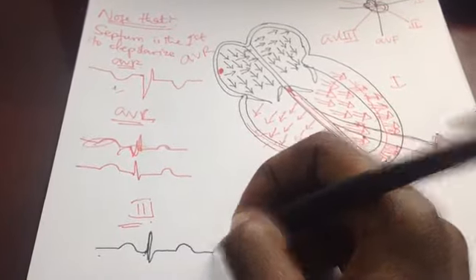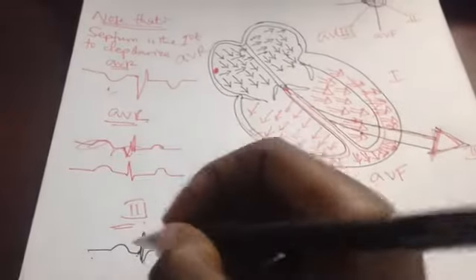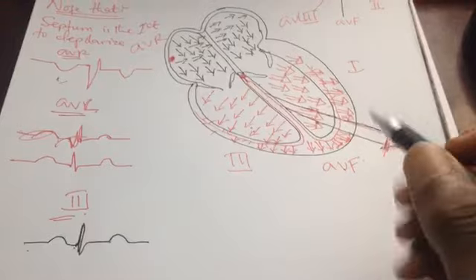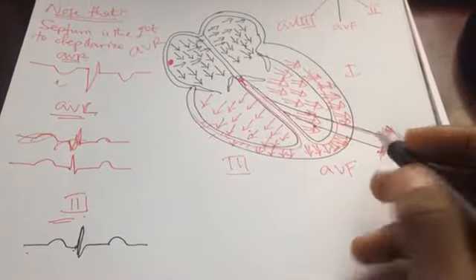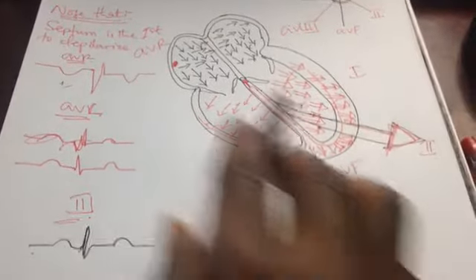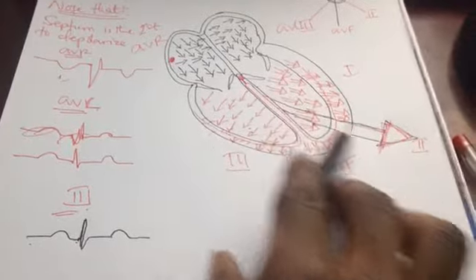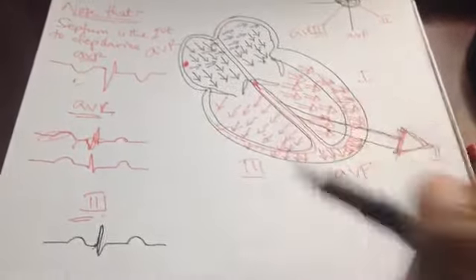So this is a T wave. This is for lead 3, and then if we come to lead 2 also, for lead 2, the P wave and then the QRS complex are going to be very much taller than all of the limb leads.